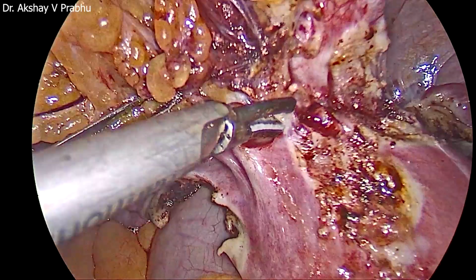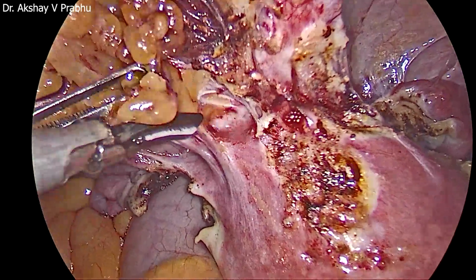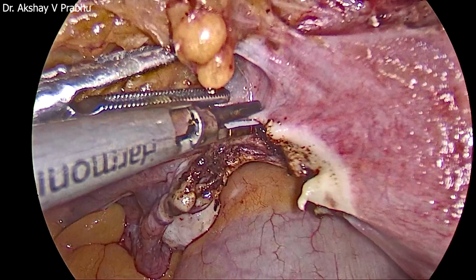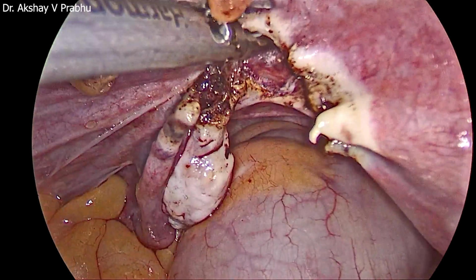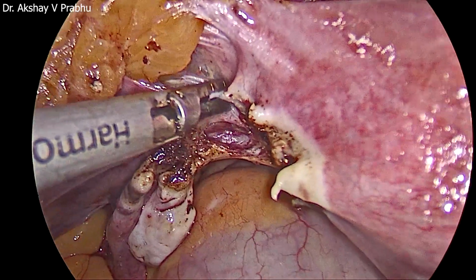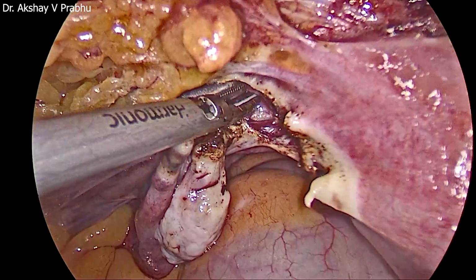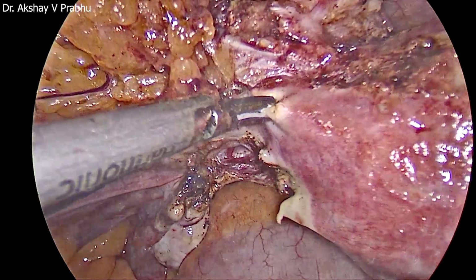So now if you can see, the adhesion band has gone down quite a bit. I am just releasing it slowly, trying to see if I can get a plane, a combination of blunt and sharp dissection. Centrally, I was not able to get much of a plane, so I again come to the left side, hoping that I'll get a plane here. Wherever required, if you don't need to cut, you can just use a harmonic scalpel for a blunt dissection. That's what I'm doing now. Just open up the jaws against pressure so that it opens up the tissue spaces.